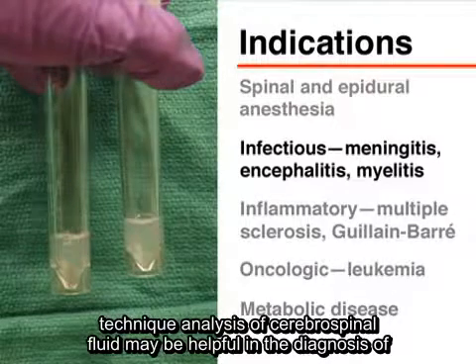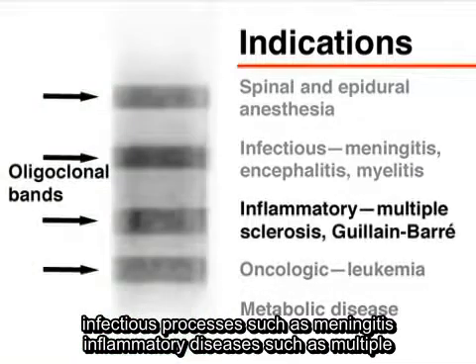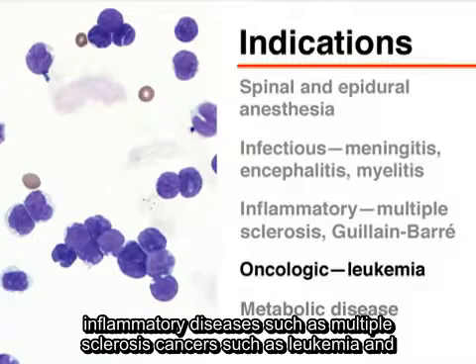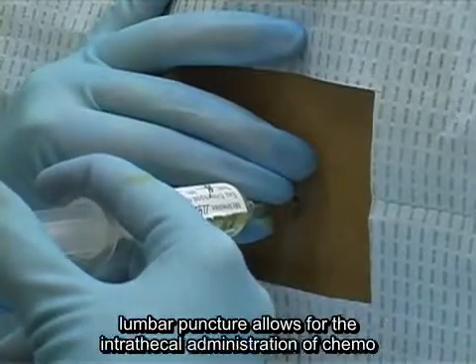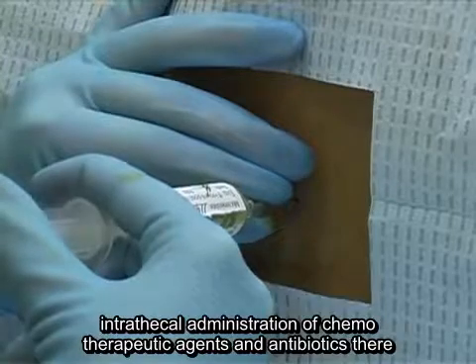Analysis of cerebrospinal fluid may be helpful in the diagnosis of infectious processes such as meningitis, inflammatory diseases such as multiple sclerosis, cancers such as leukemia, and metabolic processes. Therapeutically, lumbar puncture allows for the intrathecal administration of chemotherapeutic agents and antibiotics.